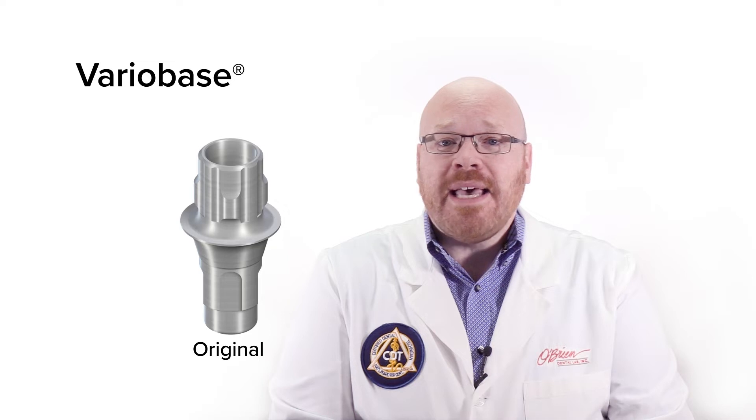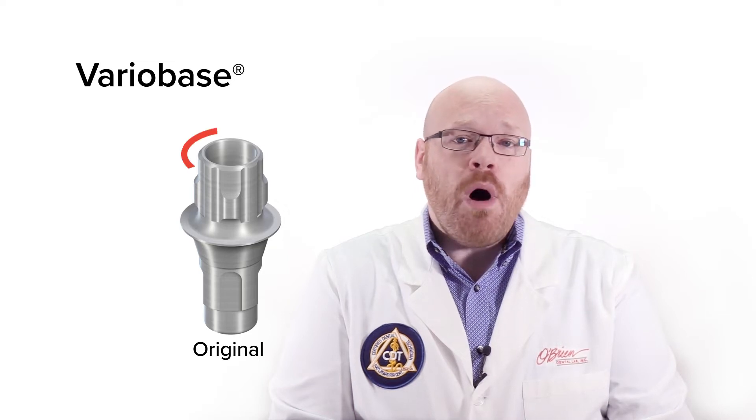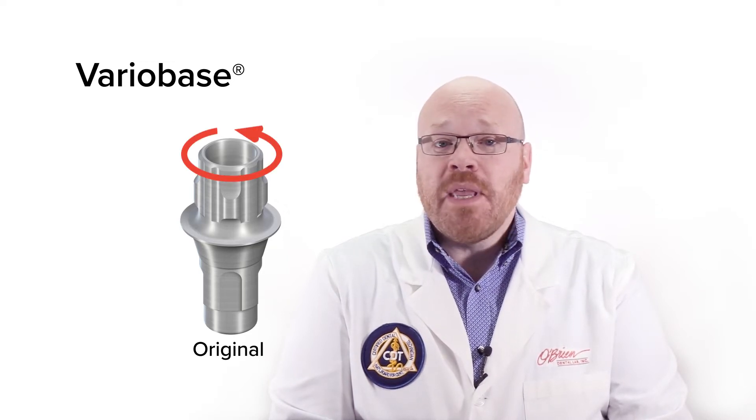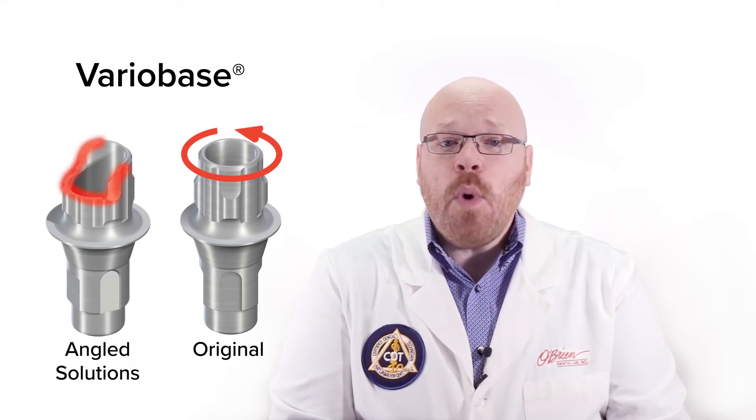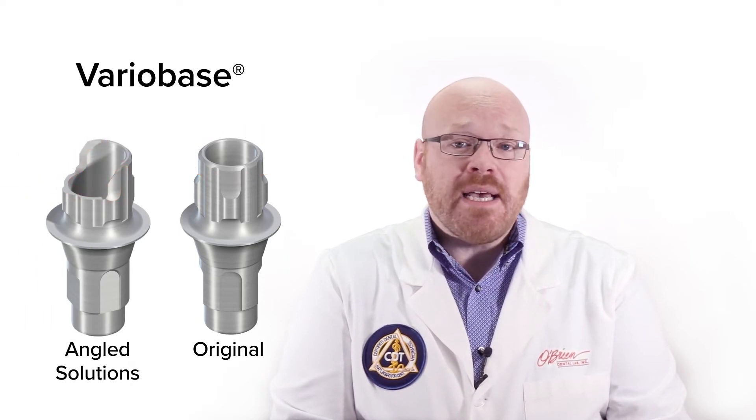The notable difference compared to the original VarioBase abutment is that on the original there's a uniform wall height all around the abutment. With the new angled solution VarioBase, one side of the abutment has been cut away, which is what allows for the angled access.